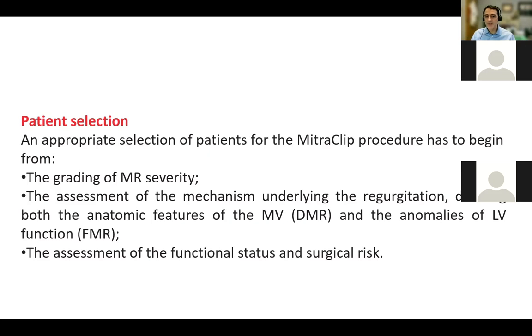The size of the left atrium is also very important, and the septum height, because we need to go through that septum and be high enough to be able to maneuver in that left atrium to be able to get in, is also something key. And lastly is the mitral valve area that we need measured. We need 4 centimeters squared of mitral valve area to know that if we clip, we're not going to end up with mitral stenosis. So the assessment is really important.